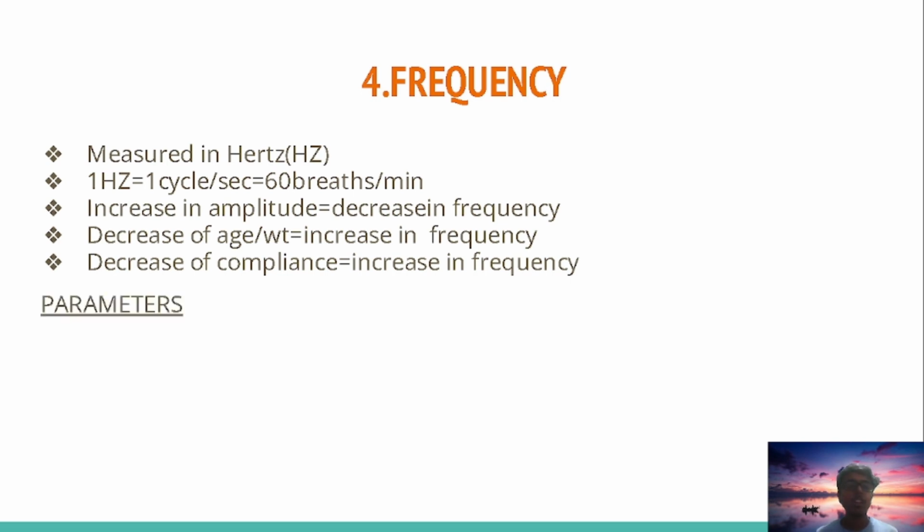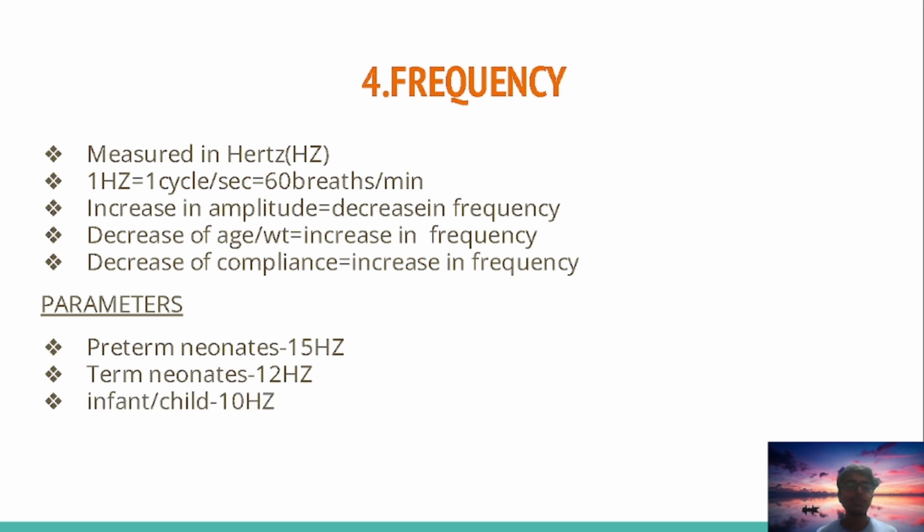So what are the parameters? For preterm neonates we will set 15 Hz, and for term neonates 12 Hz. For infants or children we will set 10 Hz, and for older children we will keep 8 Hz.